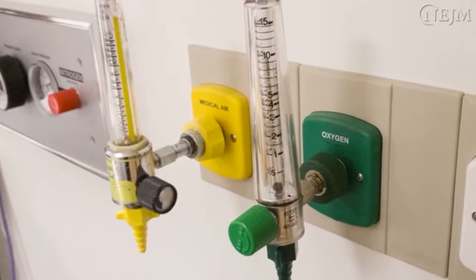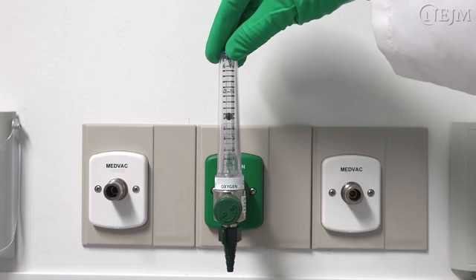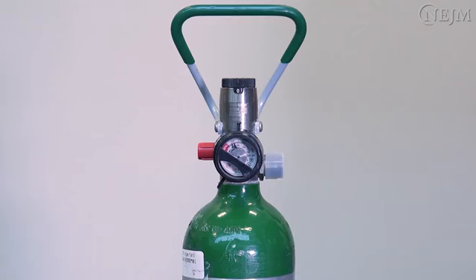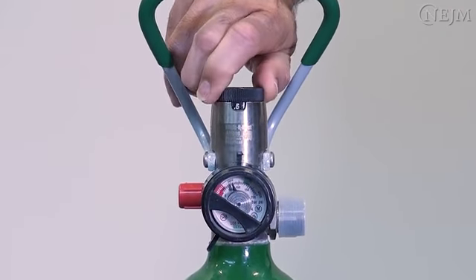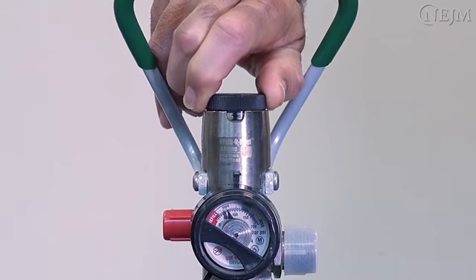Flow meters are constructed specifically for a given type of gas, since the flow depends on the viscosity and density of the gas. The meters must be oriented vertically to function correctly, since the ball is suspended in the gas stream. E-cylinders are commonly equipped with click-style flow meters, which are easy to use, sturdy, and capable of operating at any angle because they are unaffected by gravity.